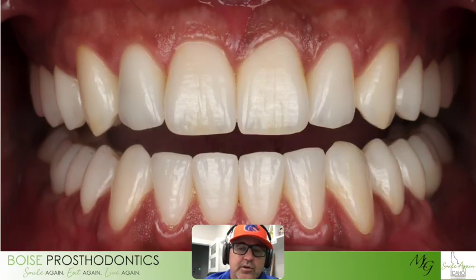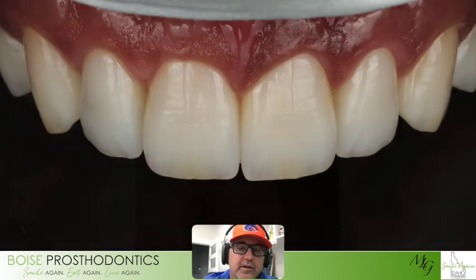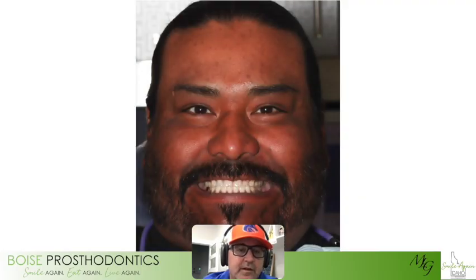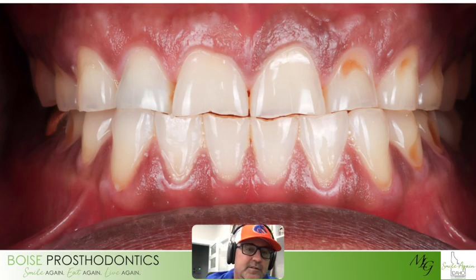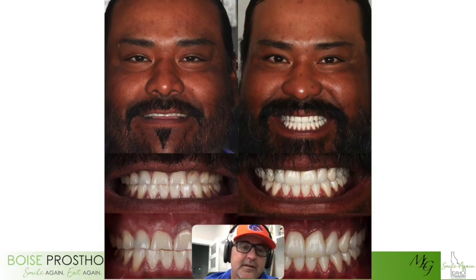And so just to showcase again Dale's phenomenal crowns in the end, I can't take credit for how amazing they look. I can take credit for the importance of the diagnosis, the treatment planning, the coordinating, the preparation of and the records provided to the lab, the discussions with the lab of ensuring it is exactly what we need clinically, and then Dale just finished it off with some phenomenal work. So there you go. That's our patient here before, and then after. You can see up close again, before and after, and everything kind of side by side.